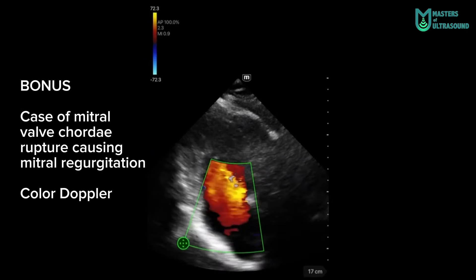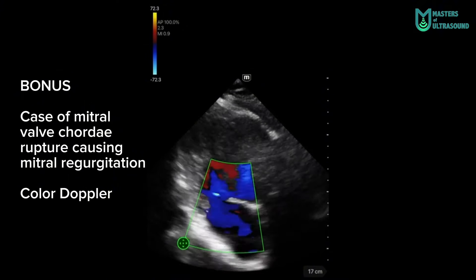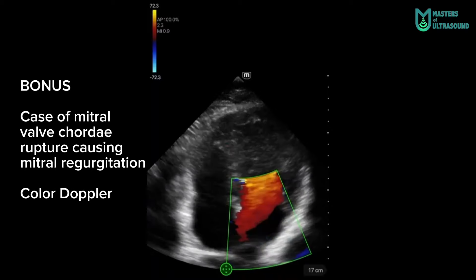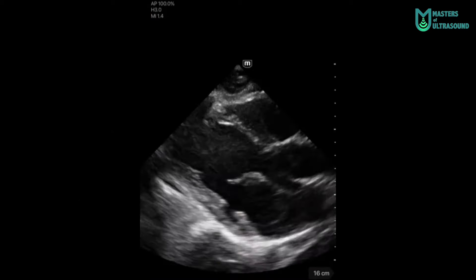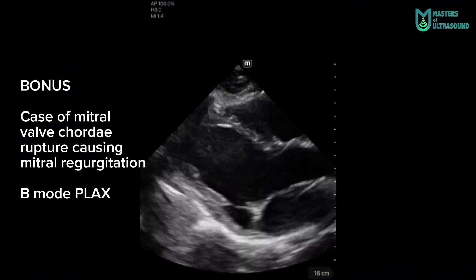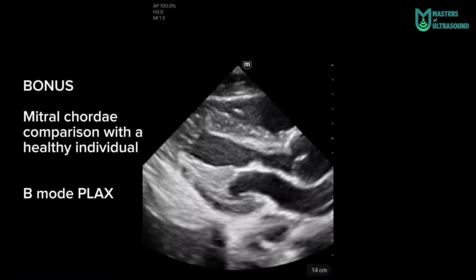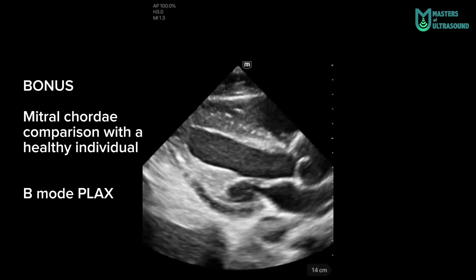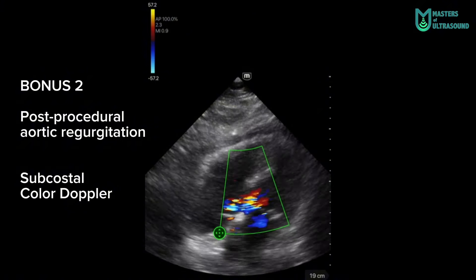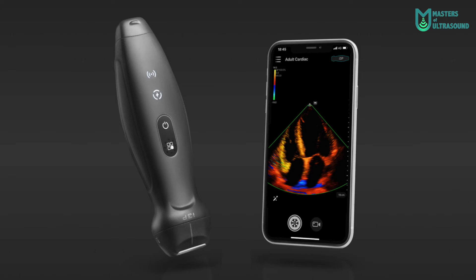Now I wanted to show two different clinical scenarios with patient permission. The first is a mitral valve chordae rupture causing mitral regurgitation — you can see the color doppler of the apical four-chamber and the parasternal long axis showing the regurgitation jet, with a comparison to a healthy patient without mitral valve prolapse. Finally, a bedside exam after an electrophysiological study showing aortic regurgitation that confirmed a clinical suspicion of a worsening patient.